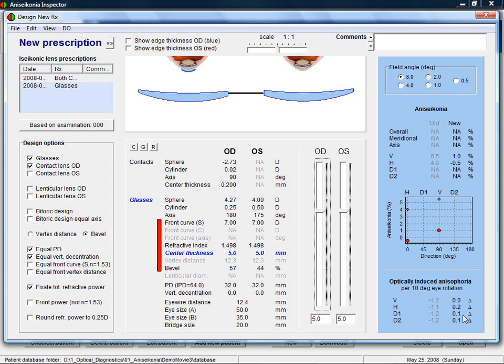This one contact lens design was more for demonstration purposes. In general, one would first see if correcting with two contact lenses would work. This is easily done by clicking on the button C.